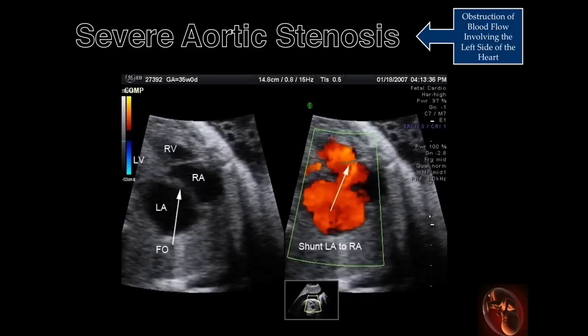As a result of increased left atrial pressure from mitral regurgitation secondary to severe aortic stenosis, blood can be observed flowing from the left to the right atrium.